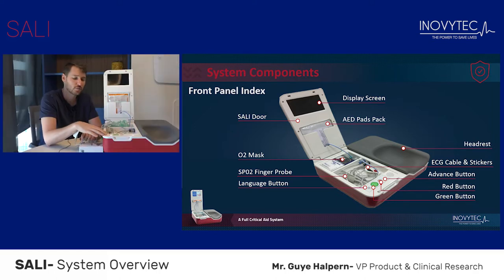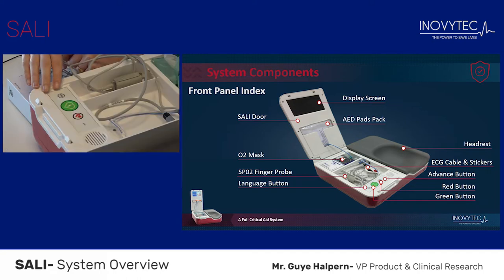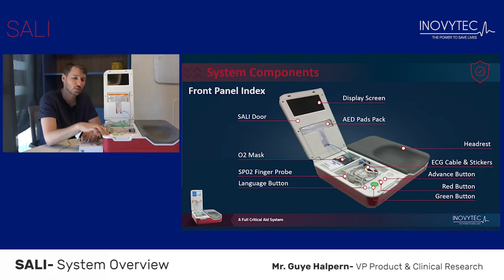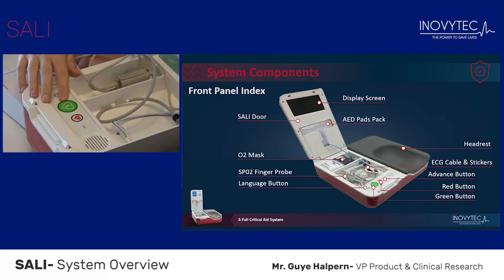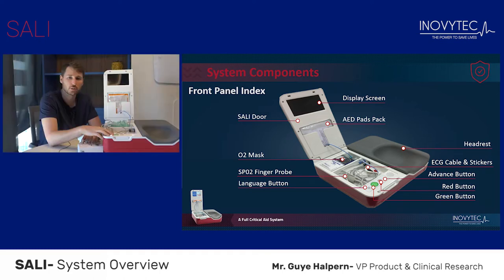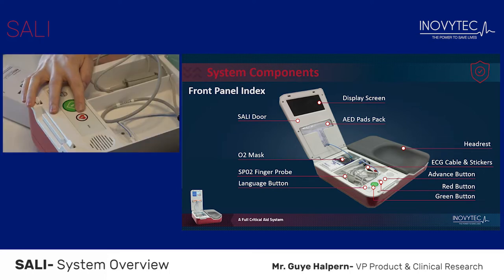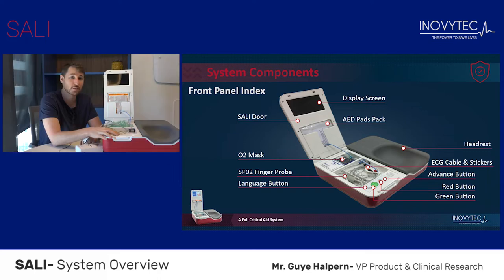The keypad has four different keys. The first is the language key, used to change languages — you can have as many languages as you want in every device. The next is the CPR protocol initiation button; press the green button to initiate the CPR protocol. The next button is the shock button — once SALI decides a shock is needed, you will press the red button when instructed.